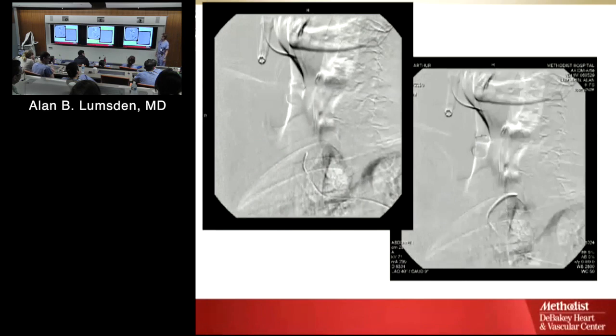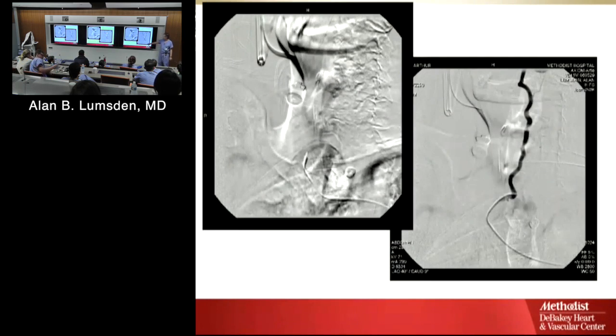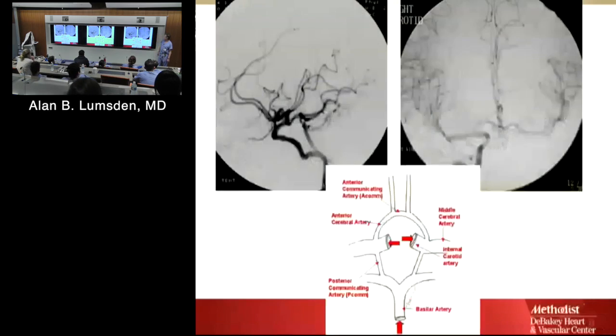You've got all these diagnostic tools in your hand. So this is an example of catheters coming up through the groin into the vertebral artery, and we start injecting in the vertebral artery. Maybe you've done an angiogram? Anybody been involved in doing an angiogram? Okay, all righty. And so this is us doing an angiogram.